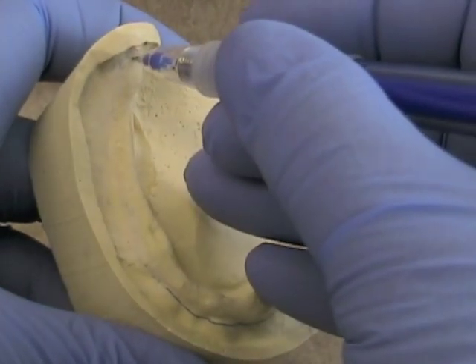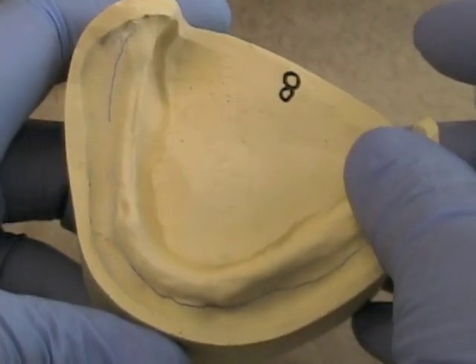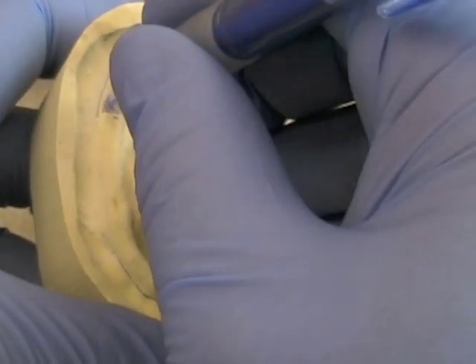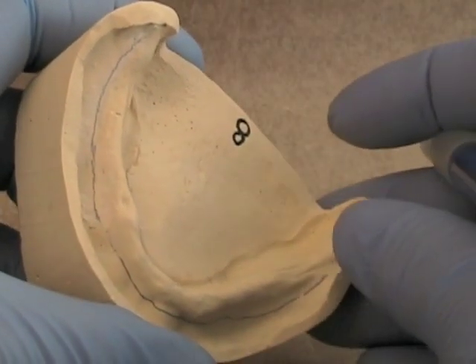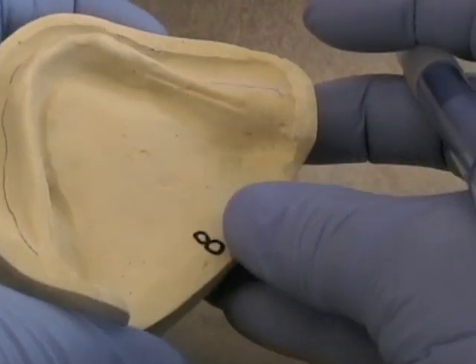And again, on this side, we're going to stay on the vertical portion of the ridge, several millimeters shy at the vestibule. Don't get on the horizontal portion of the vestibular roll. If you do make an error, you're better off making the tray a little bit longer rather than a little bit shorter. It's easier to grind off excess tray rather than try to add compound that's very, very short of where your vestibular height is.